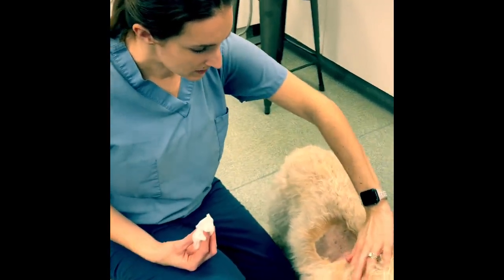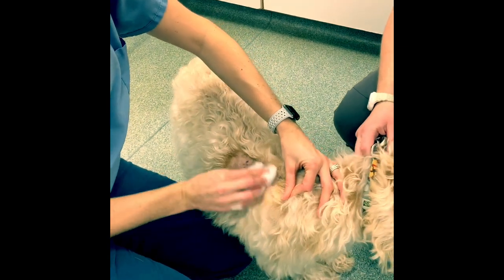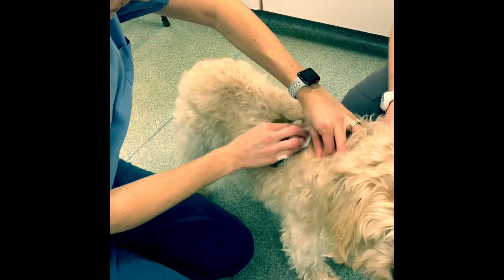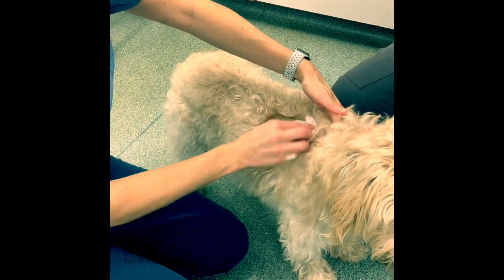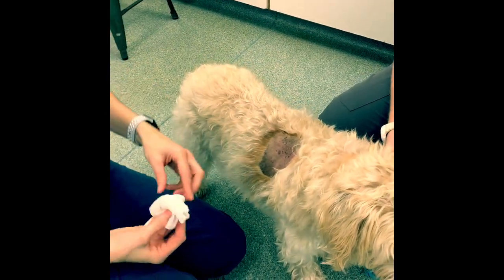We've shaved a spot where we're going to put it and we have to clean the area with alcohol. I've already cleaned it a couple times but we're going to make sure we get the spot nice and clean and then let that dry for 30 seconds so all the alcohol is off.